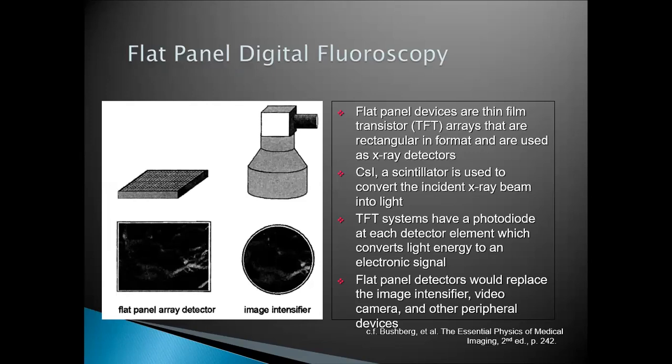The flat panel, as distinct from the image intensifier, is that the array, the electronics, or the solid semiconductor used for this is flat. It's not circular.